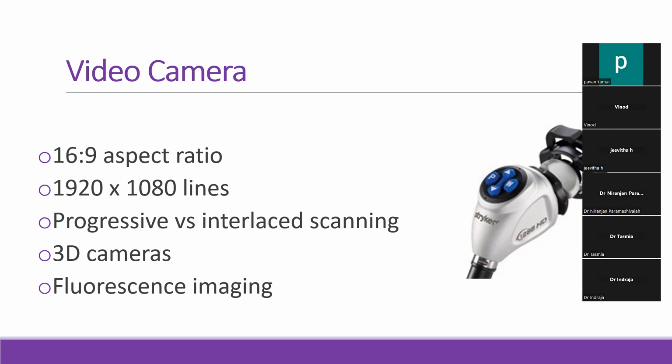Resolution. So what is this resolution? What does this specify? This is an HD resolution. Okay. What is a lower resolution? What is the standard lower resolution? 640 × 480. What is 4K? Higher or lower than HD? Today's standard is 4K. It is much higher than HD. I forget the actual lines on it, but it's much higher than the HD lines here.